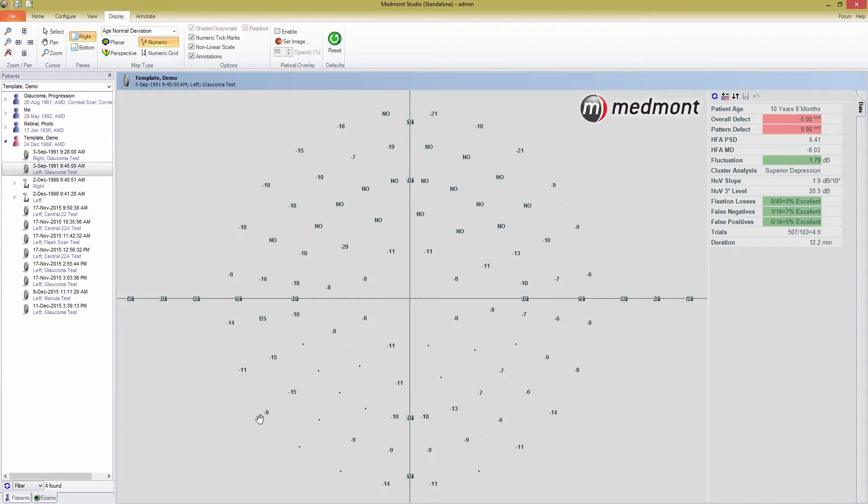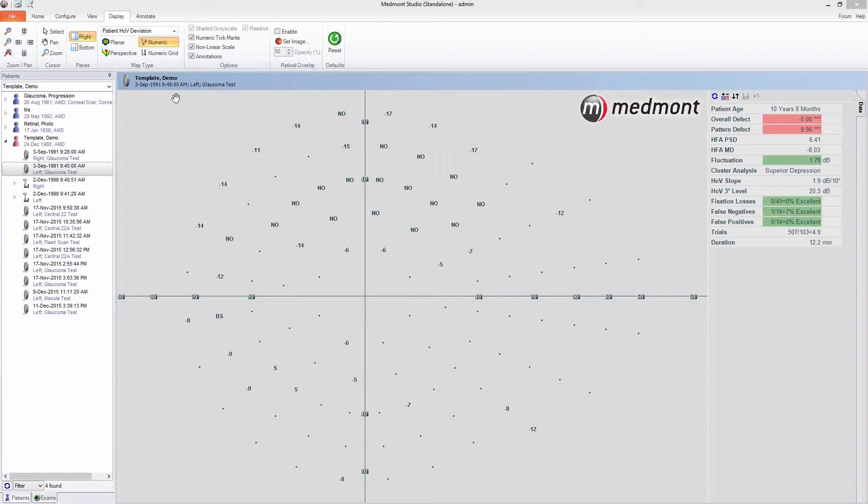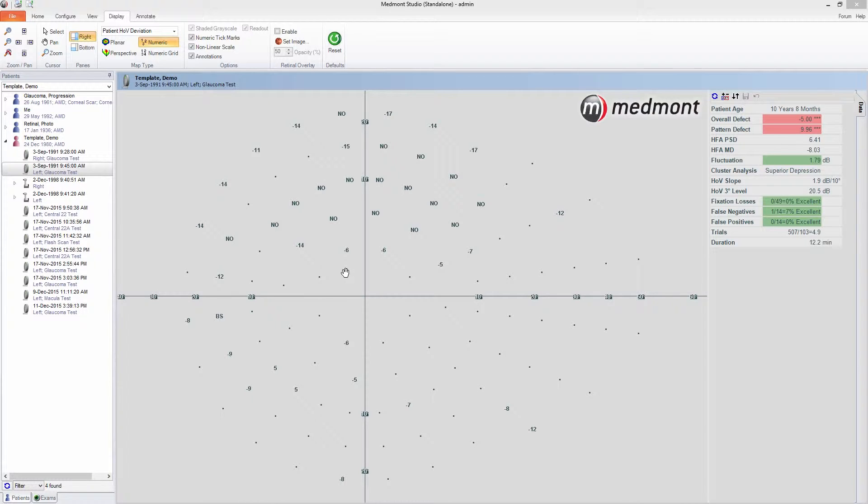If you move down the drop-down list, you find the patient HOV deviation map type. With this map type, the software makes the best guess at what the patient's HOV would be in the absence of localized defects, and then plots defects against this HOV. Taking a simple curve through the patient's best vision, or a mean across the field, can produce an HOV that's more or less depressed than what it actually is. The software uses a robust statistical elimination technique to estimate the true underlying HOV without areas of localized defects. Stimulus points in the first 15 degrees that are within 4.5 dB of the HOV and within 6.5 dB past 15 degrees are displayed as a single dot. This view is important in identifying areas of localized field loss in a field that is depressed overall, as it makes it easier to identify these depressions.